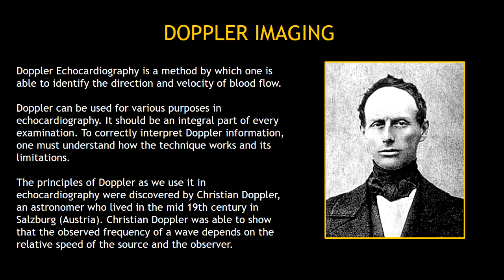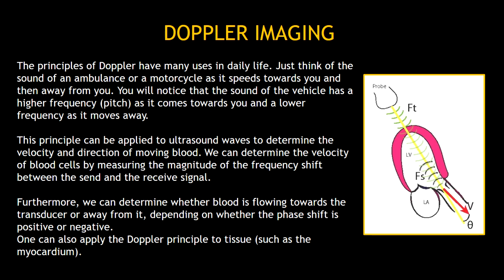The principles of Doppler as we use it in echocardiography were discovered by Christian Doppler. Christian Doppler was able to show that the observed frequency of a wave depends on the relative speed of the source and the observer. The principles of Doppler have many uses in daily life. Just think of the sound of an ambulance or a motorcycle as it speeds towards you and then away from you. You will notice that the sound of the vehicle has a higher frequency as it comes towards you and a lower frequency as it moves away.